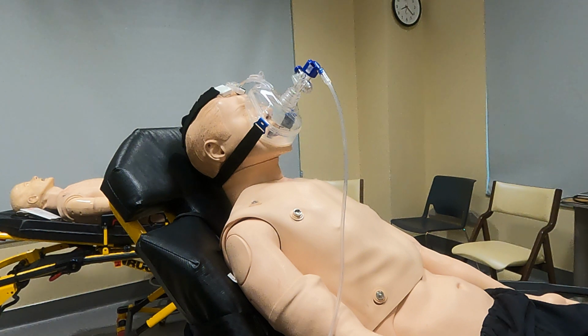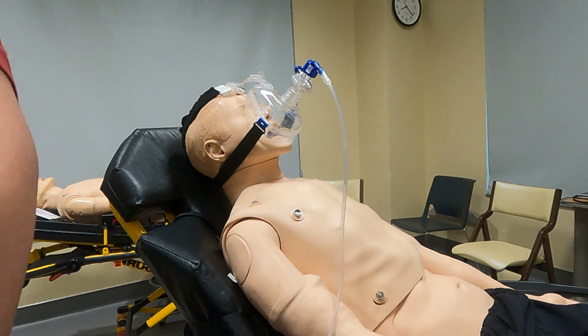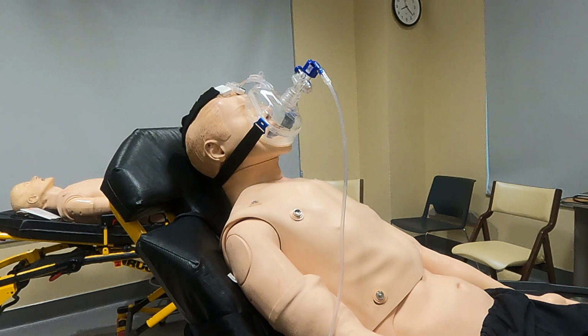The great thing about CPAP is it works pretty quickly. You will see a very quick turnaround. If it's going to help them, it usually starts helping them within a minute or two, and they'll start telling you, I'm feeling a lot better, I'm breathing a lot better. The important thing is once you start CPAP, unless your patient stops breathing or goes unresponsive, don't take the CPAP off because it can quickly reverse back to how they were.